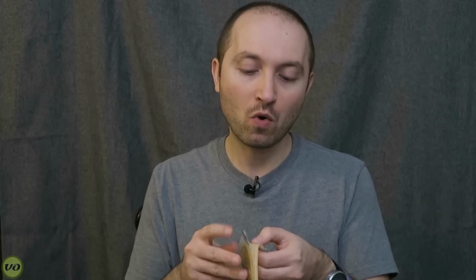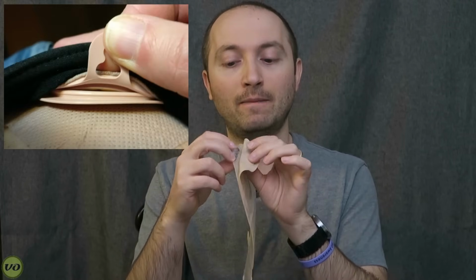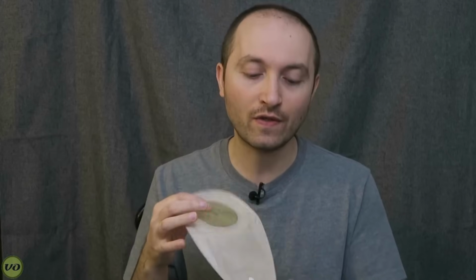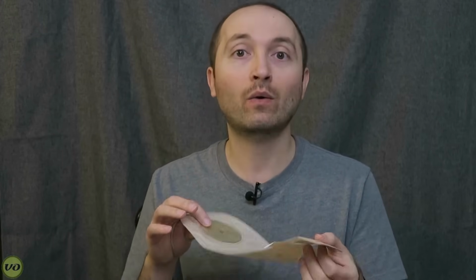So that's another thing. One other problem that some people may have with a one-piece system is the fact that you can't burp your appliance the same way you would on a two-piece. Now, for most people who are burping their appliance, they tend to just separate the flange area, let a little bit of gas out, and then snap it back together. On a one-piece system, you can't really do that. You have to go through the bottom if you want to burp your appliance, and that requires you usually to lay down, and there's a few extra steps there, so it's not as convenient.